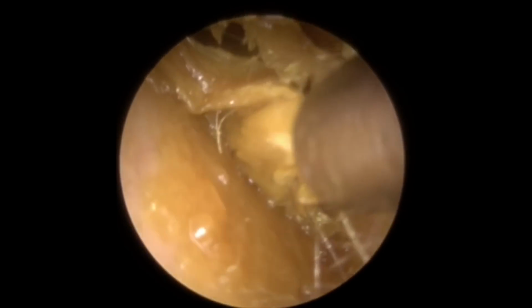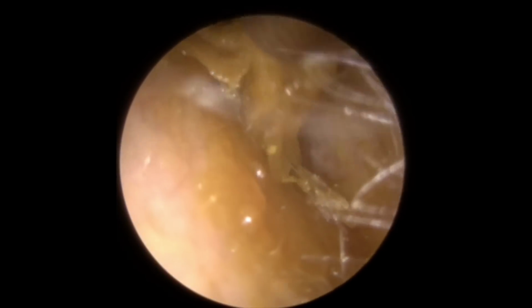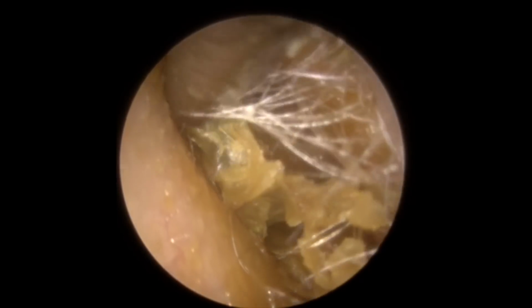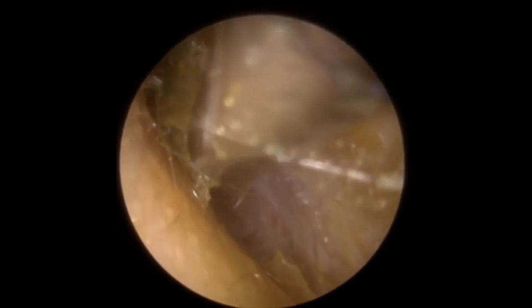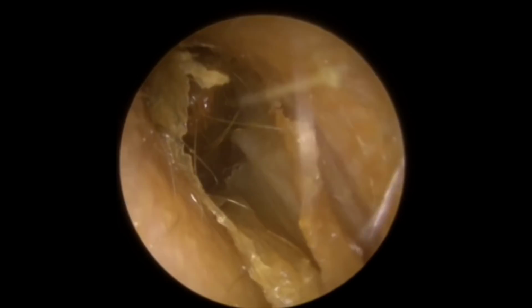Now look at the color difference. When we start to lift this up, you'll see this is dead skin, but then you'll see the pink skin underneath, which is actual healthy skin. Whereas this is all very dry, almost gone like a borderline leathery consistency where it's hardened up. There, see the pink skin underneath? So that's the skin we should be seeing in the canal, but this is just layer upon layer of dead skin on the top. Just pulling away on that outer part of skin there.